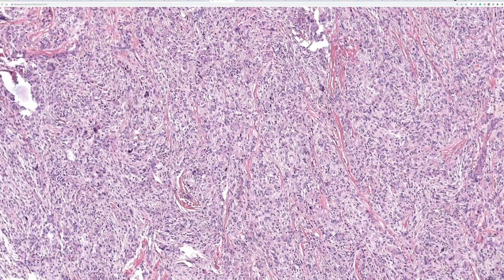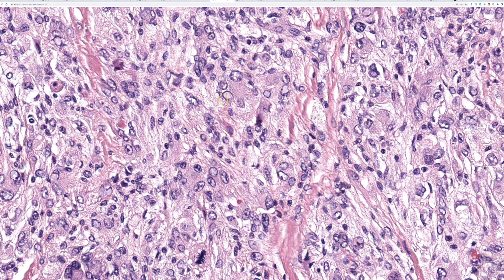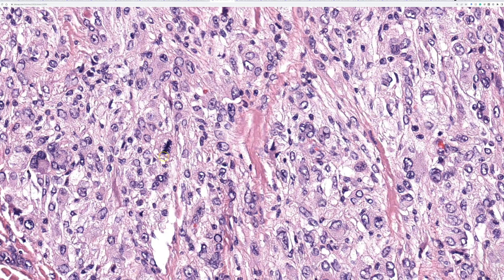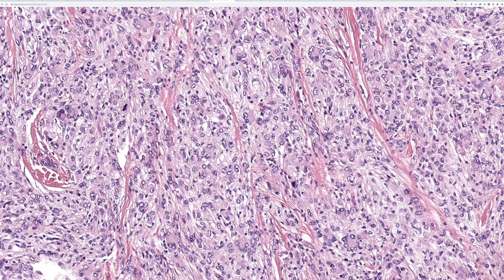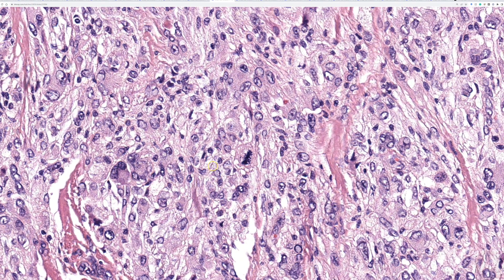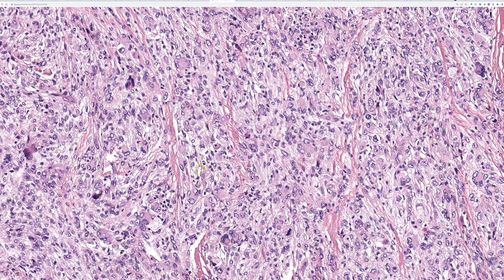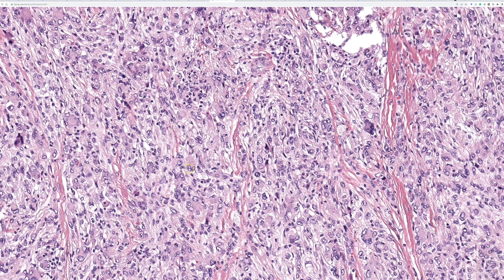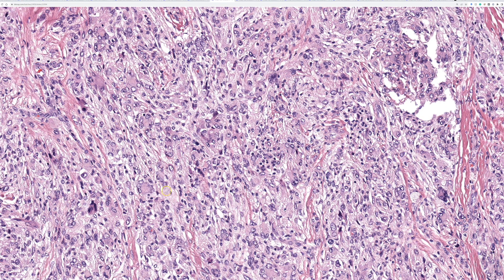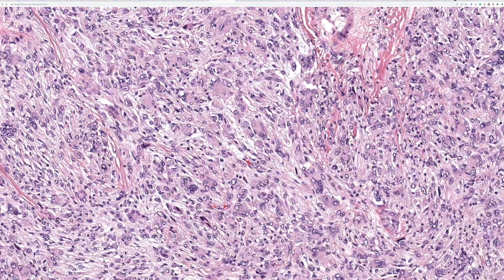This cellular area looks quite bad - large cells with large nuclei, open chromatin, very pale washed-out or vesicular chromatin, and mitotic activity. Mitoses often don't stand out as well on scanned slides, but there were a fair number here. We have a cellular tumor with large nuclei and scattered pleomorphic cells, and on the glass H&E I saw several atypical mitotic figures. High cellularity, large nuclei, pleomorphism, increased mitotic activity, and atypical mitotic figures - it's checking a lot of boxes for malignancy.